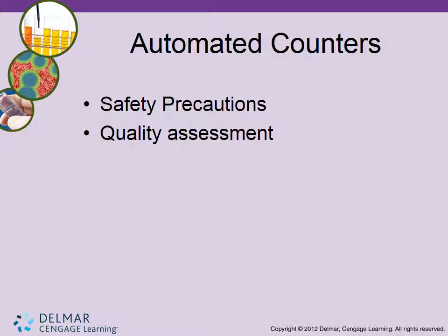If you remember, your manufacturers do provide calibrators and controls and also specify the frequency of when you should calibrate and use controls. A lot of our labs use an inexpensive method of quality control, and this involves choosing maybe 5 or 10 samples from a day's workload that have results within normal reference ranges, and reanalyzing these throughout the day. Others use manufacturer controls to run throughout the day, and also reanalyze patient samples to watch for trends or shifts with the analyzer.